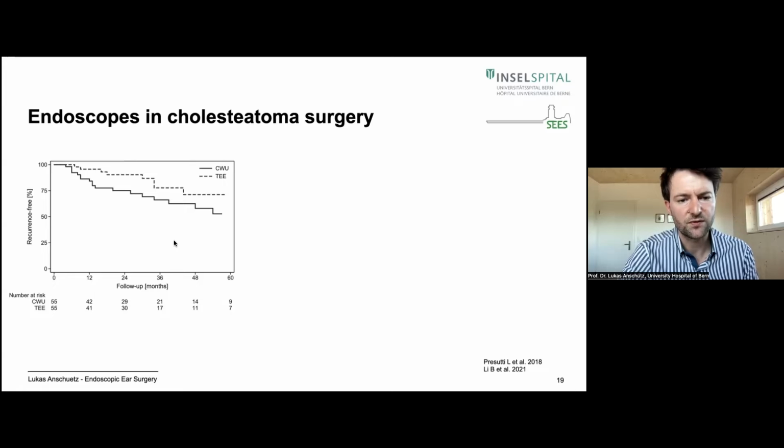He's one of the pioneers of endoscopic ear surgery, but a very skilled middle ear surgeon and lateral skull base surgeon all the way. And you can see here, if you take same size cholesteatomas and you have a canal wall up procedure, the recidive over the years is higher than if you use only an endoscopic approach. And I think the reason here is that if you spare the mastoid, you can really preserve the organ, and the buffer effect will make you have less recurrence.